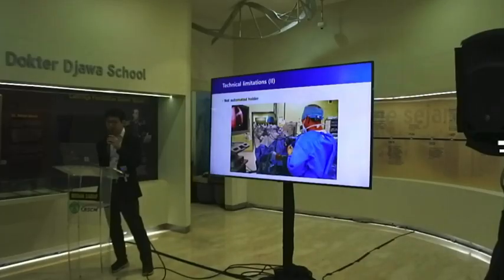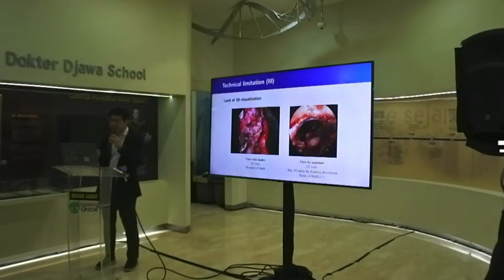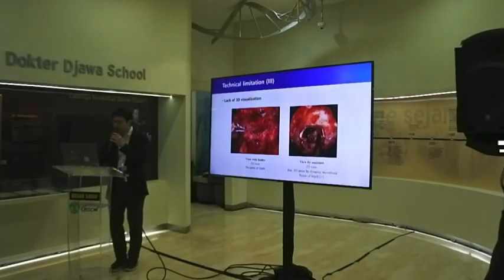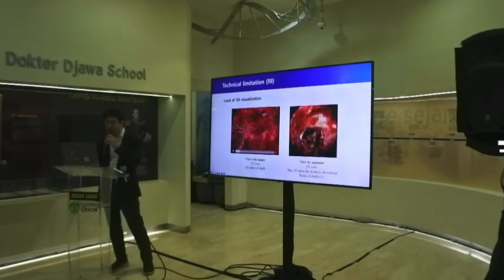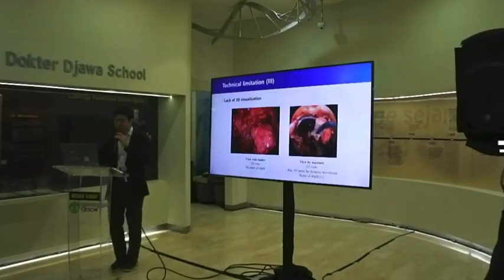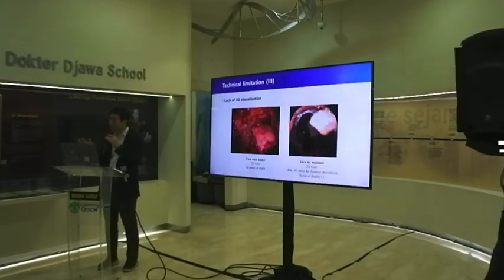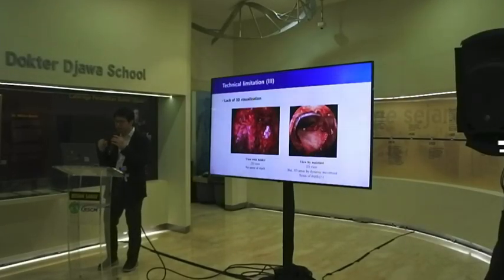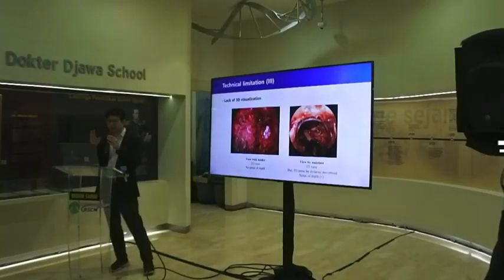And perhaps the biggest limitation is the lack of a true 3D view, while the view on the screen is 2D, two-dimensional. A skilled assistant's dynamic movement of the endoscope helps the surgeon gain a sense of depth. That's why the assistant is important: if the assistant freely rotates the endoscope, the surgeon can feel the 3D view.